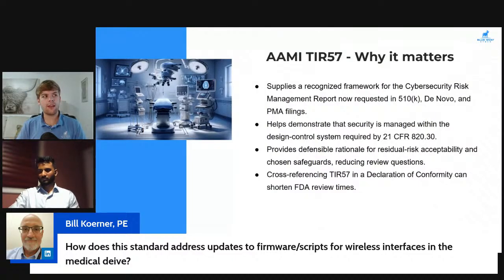Where we'll get more into the technical testing and the execution is going to be NIST Special Publication 800-115. That's where we look at the actual penetration testing flow or security assessment flow, where we'll say we can identify that there might be X, Y, and Z risk in a wireless interface. If we're using a cloud-based server, we're going to identify other risks, and then we're feeding it into this risk assessment. So it's a little bit of an open-ended response, I guess, but in short, this is more just the process for evaluating these risks.